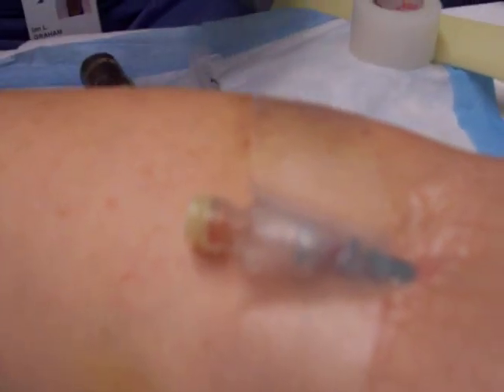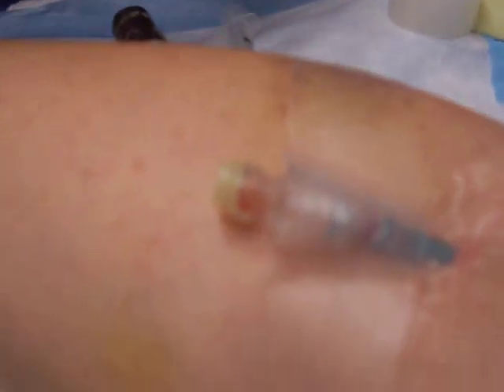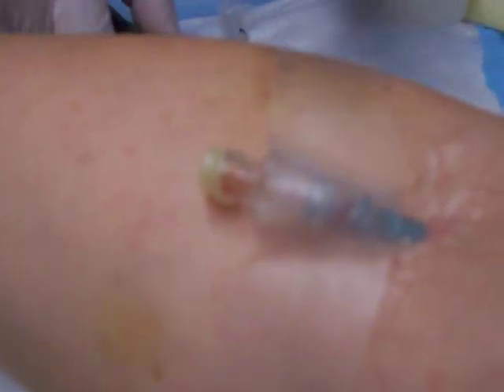Don't worry, nothing will clot on me. You're on the blood thinners, that's right. Oh man, nothing clots — it bleeds forever.